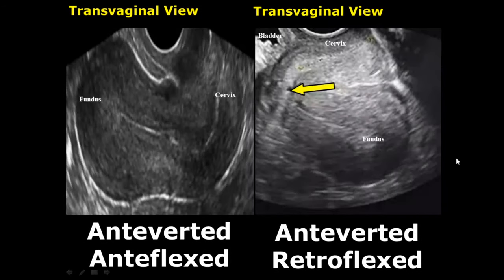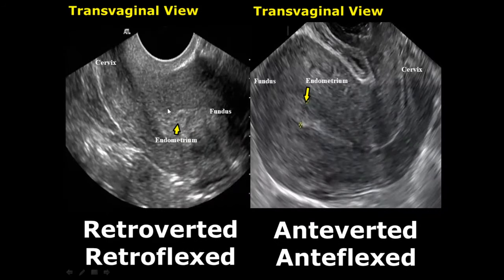In the retroverted and retroflexed uterus, the cervix is tilted posteriorly and the body of the uterus is also facing posteriorly. You can see it on the right side of the image because the bladder will be appearing on the top left or left side of the image.